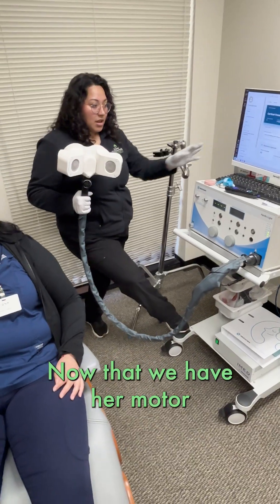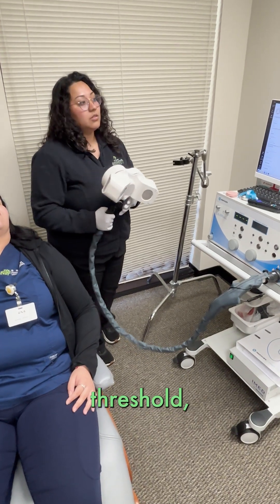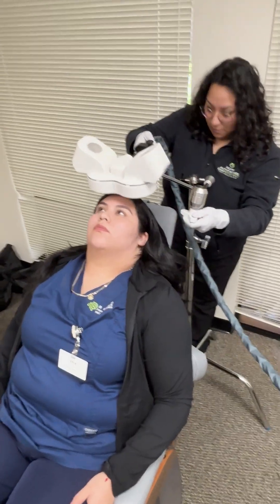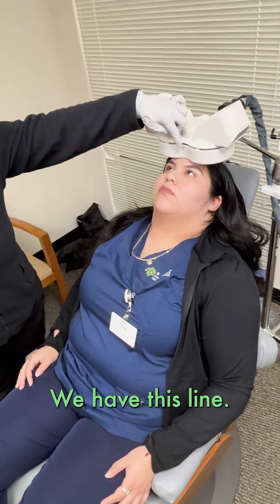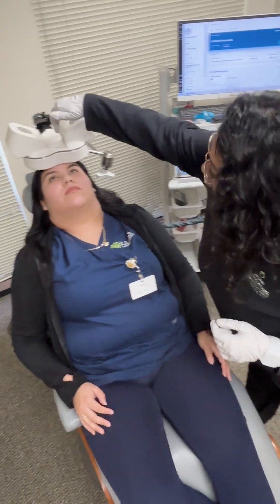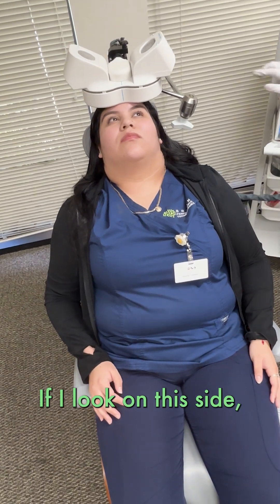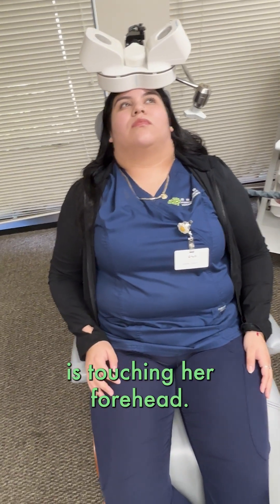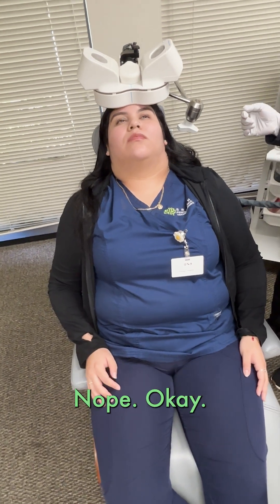Now that we have her motor threshold, we can start her treatment. We have this line, and we try to center it with her nose — it's centered. Looking on this side, the middle part is touching her forehead. I can still adjust. Is it heavy? No? Okay.